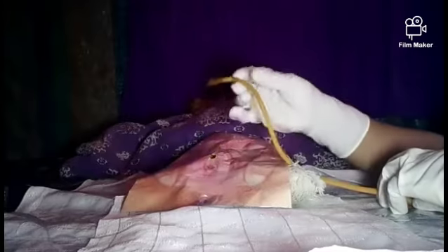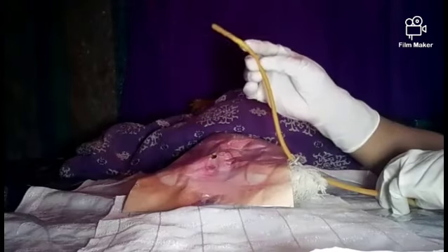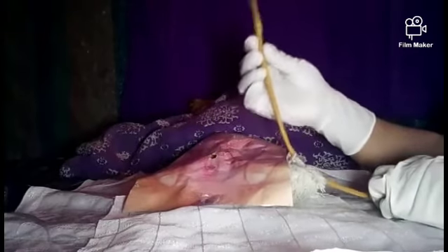Inspect the catheter to make certain it is intact, and if it is not, notify the physician immediately. Measure the output in the drainage bag, record the output on the I&O sheet, empty the urine into the toilet bowl, and dispose of the urine bag into the yellow bin.